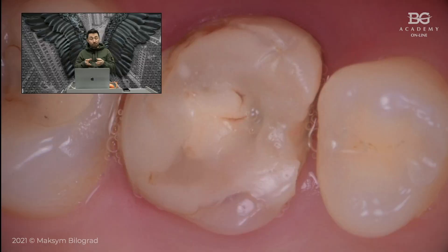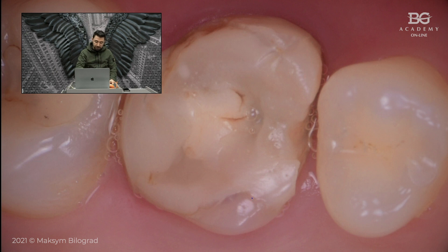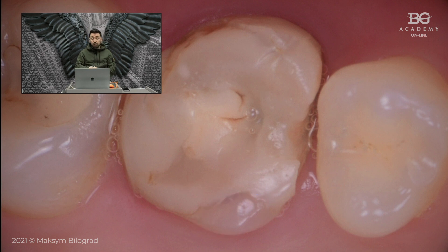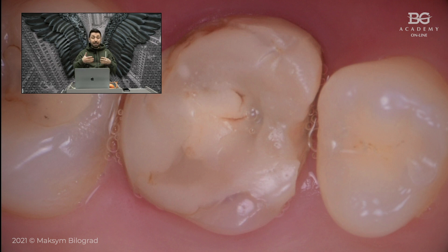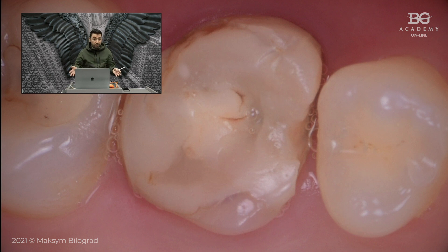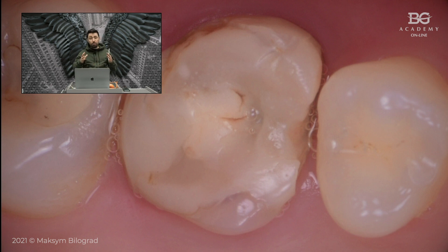Here you can see the initial situation and a big composite filling. If you notice, it is already a crown made in the patient's mouth with composite. The only very small portion of sound tooth structure was kept from the palatal side. Because of indications — when you have a huge surface covered with composite or carious defects and need to replace it, the only way in such cases will be a crown restoration. I just need to make a finish line, design the crown properly, and we are ready for the next step.